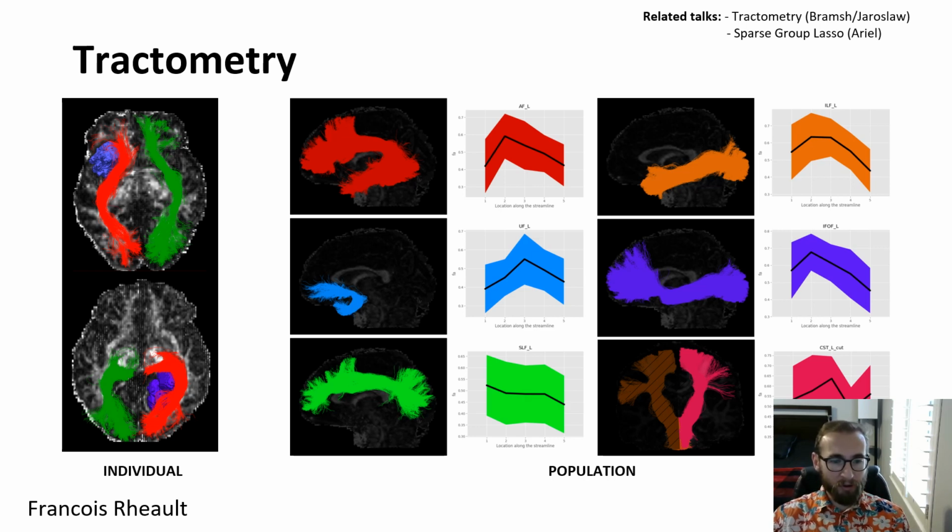This is another example where there is a tumor that is kind of lodged inside of the optic radiation. So it's pushed inside of the curve, and the bundle seems quite symmetrical. It seems complete and in the right place. So you could say, maybe this is still working. Maybe this is still viable. So this will impact the decision of the surgeon, or maybe not, he is the surgeon, he decides. But it's important to know that for an individual, bundle segmentation can be useful.